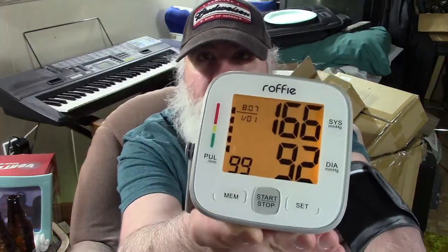I'll press the button. There's the display and it starts automatically, so I'm going to sit here and let it do its thing. I got a reading of 166 over 92. I've been running around doing stuff and did not have the requisite five minutes to sit and relax, so that's why my pressure is a little high.